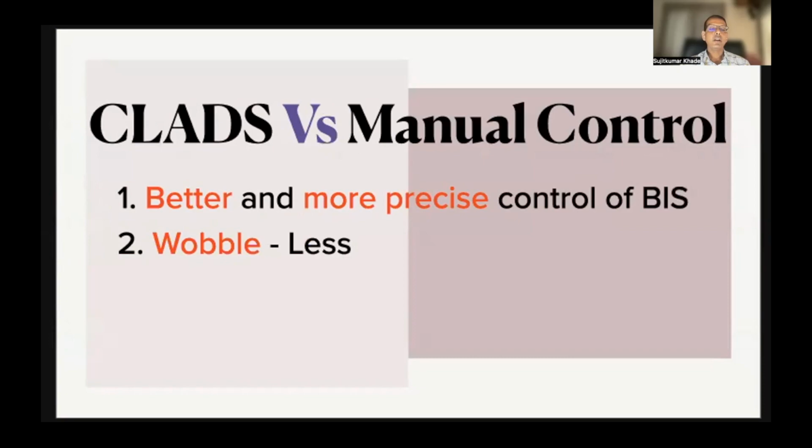This outcome was greater in the manual group, and it is not unexpected, as it results from dose adjustment by different anesthesiologists, some repeatedly overdosing and some others repeatedly underdosing. In contrast, the dose adjustment in the CLADS group was more gentle and frequent, resulting in less tendency to wobble around the target. The global score was lower in the CLADS group, indicating a better overall performance. Therefore, the current results confirm the superiority of automated control over traditional manual control in maintaining consistent depth of anesthesia.